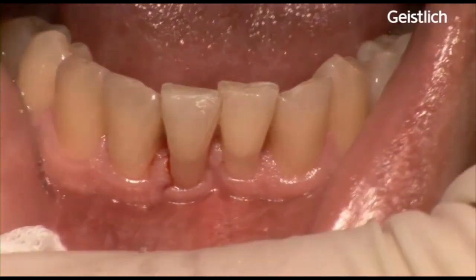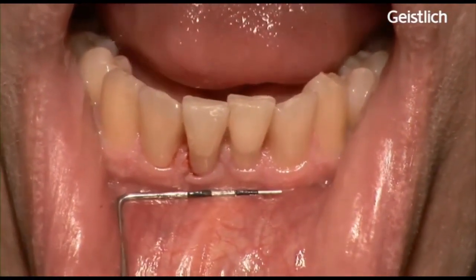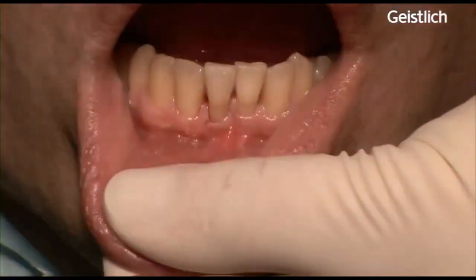Any mobility of the mucosa is going to compromise a successful periodontal healing process. In this case, no preoperative medication was needed.